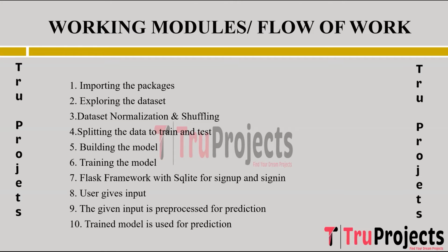Applying the trained machine learning models such as pre-trained ResNet-50 and LeNet to predict Alzheimer's disease based on processed input data. These models utilize learned patterns to classify or predict AD. Final outcome is displayed through the front end, showing the prediction or classification results to the user via the front-end interface, offering insights into the predicted diagnosis or outcome of Alzheimer's disease based on the input data.